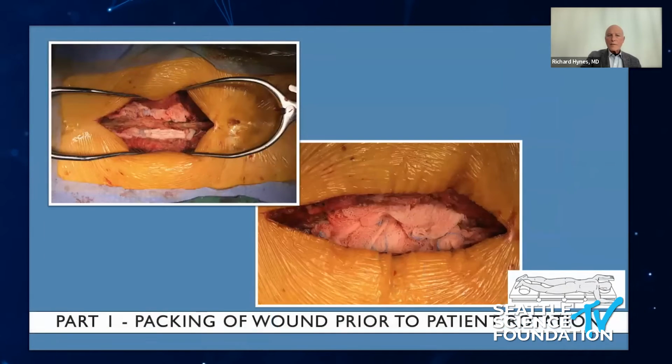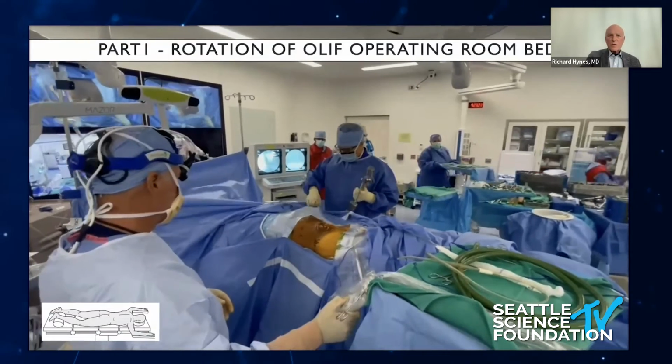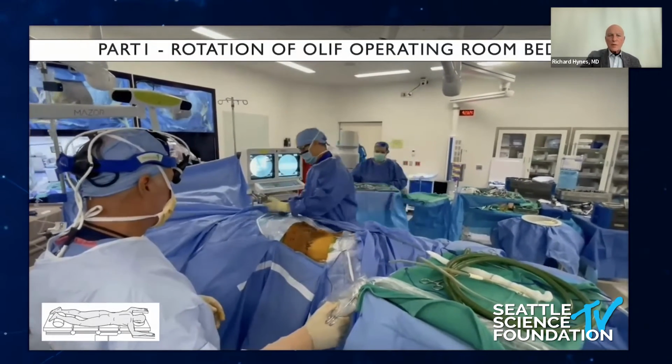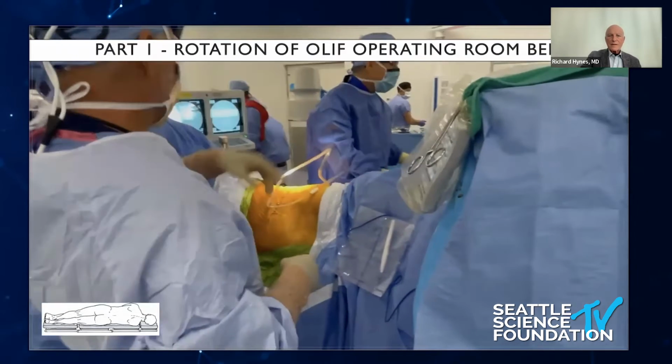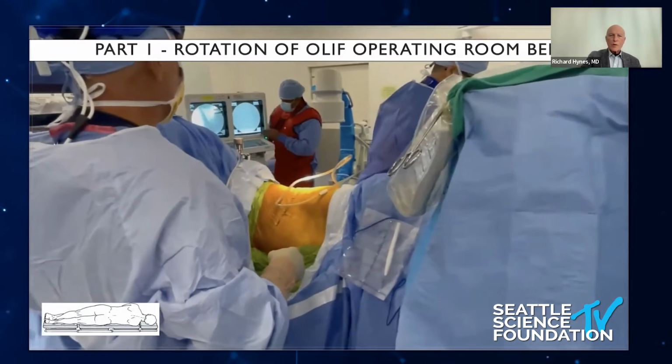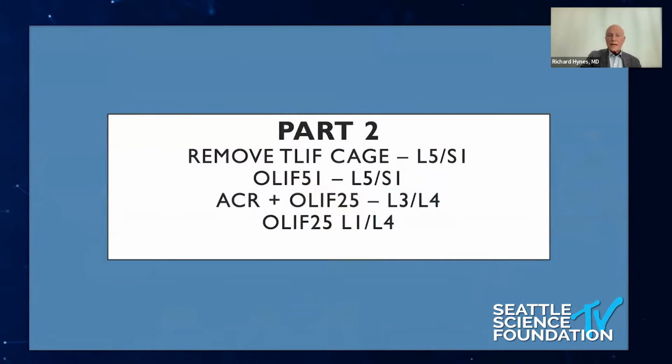We can then pack off and then go back. And now we want to do our lateral surgery. We just rotate up for the anterior component. And you can see the patient now in about 10 seconds is ready for a lateral approach in a lateral position. And then here we're going to remove the TLIF cages safely at L5-S1, perform an OLIF at L5-S1 to restore lordosis, and then add a more harmonic correction by doing an ACR at L3-4 and add the other additional degenerative levels for the scoliosis, L1 to L4.